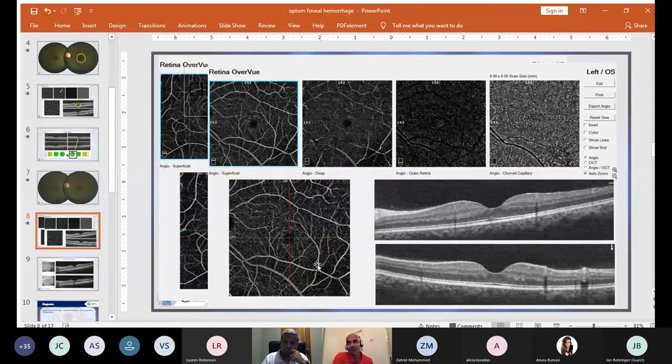As I said, they don't usually present with an acute bleed like that. But let's say we didn't have OCTA or we couldn't do an angiogram. If somebody gets an intraretinal hemorrhage and you're thinking it has some MacTel features, then you really need to look out for clinical features or OCT features of a CNVM. That would be not only hemorrhage within the intraretinal layers, but also subretinal hemorrhage, subretinal edema, or intraretinal edema or cystic formation. If you see anything like that, then you're going to be thinking it might be a CNVM and we're going to have to use some sort of anti-VEGF.